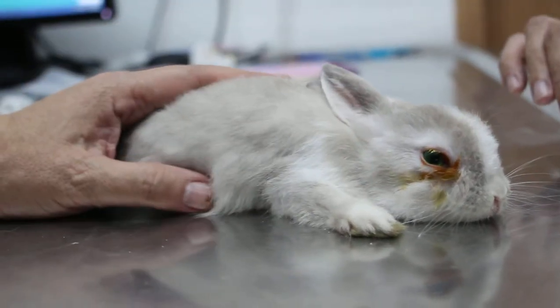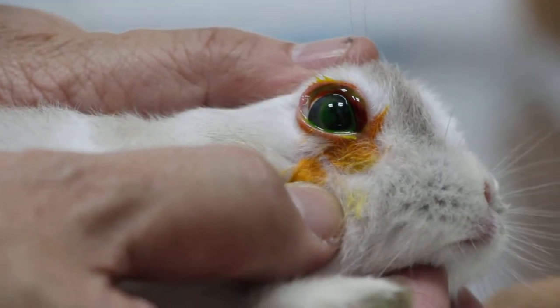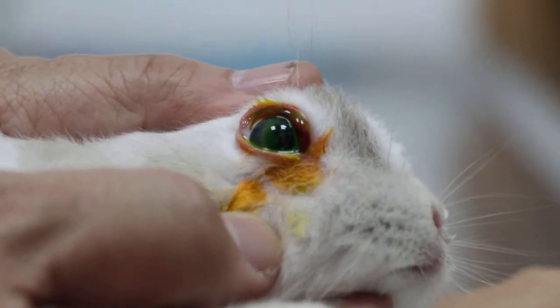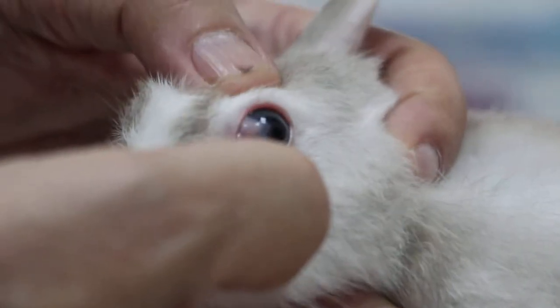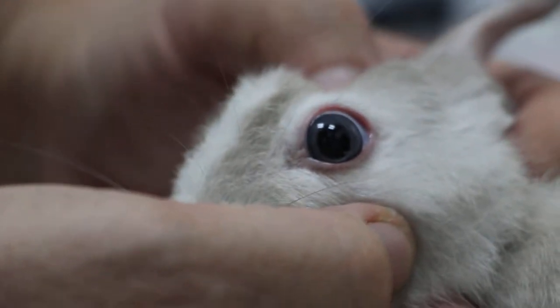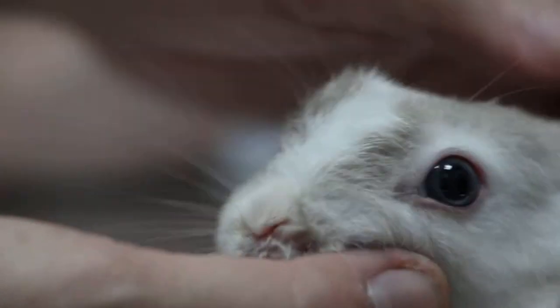Is it very clear now? Is it very clear here? You have to go close, you know — very close to it, just as close as you can get. Then I will show the clear eye. You see the green? On the cornea. This eye — the normal eye — should be transparent. The cornea there, very transparent, very clear. You can see the pupil is black. Everything is clear, like plastic. They are very clear.